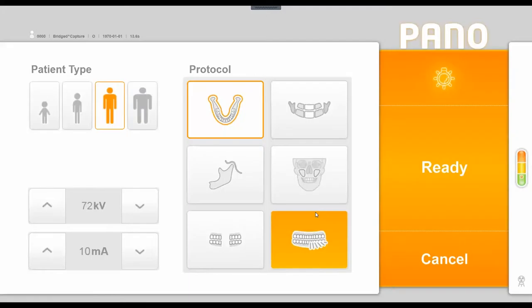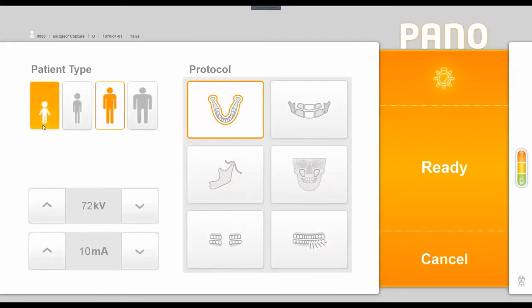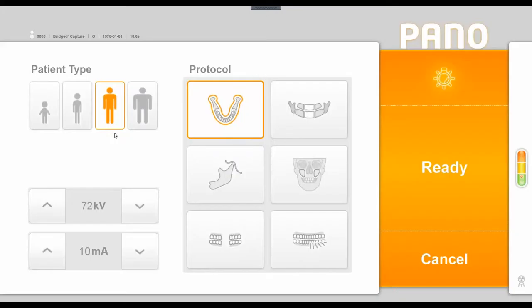Once we're in this interface, we have options to choose our patient type from a child setting to a small, medium, or large adult. You'll notice that it defaulted to the medium adult patient once we came into the interface. If these preset sizes are not adequate for you, you can change them using the manual adjustments of KV and MA in the lower left corner.